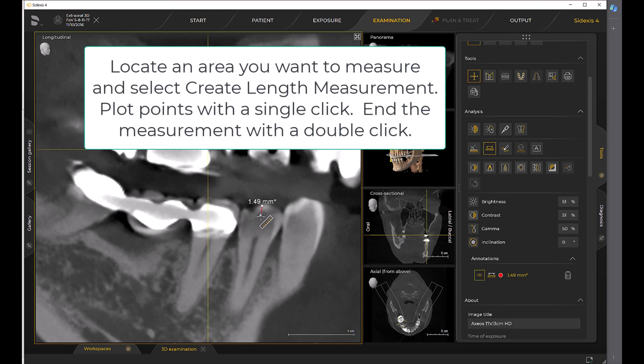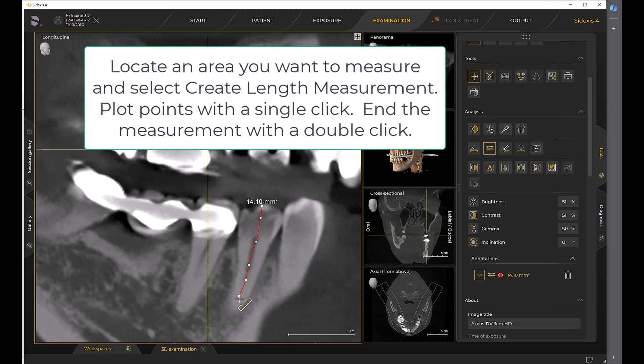Locate an area you want to measure and select Create Length Measurement. Plot points with a single click. End the measurement with a double click.